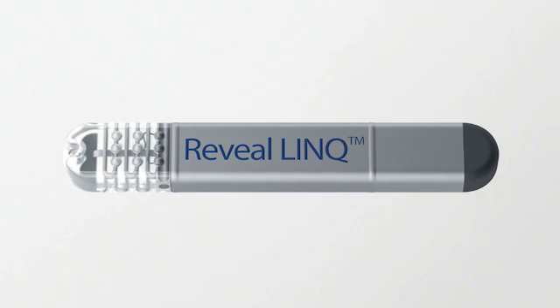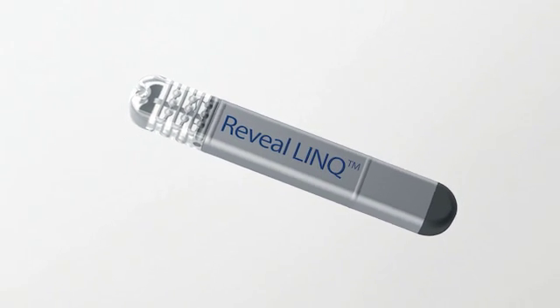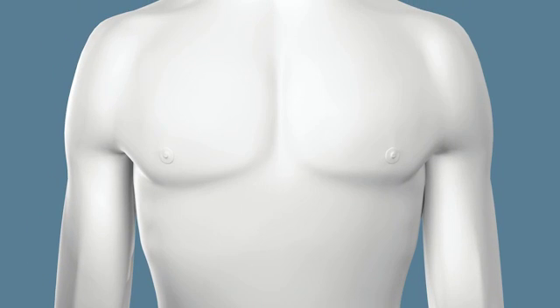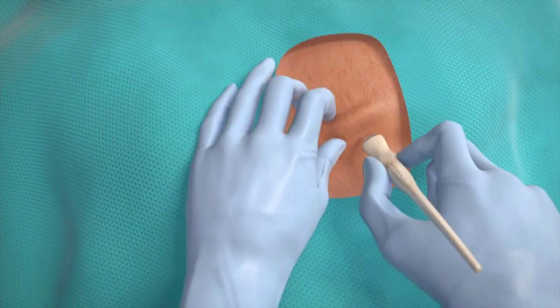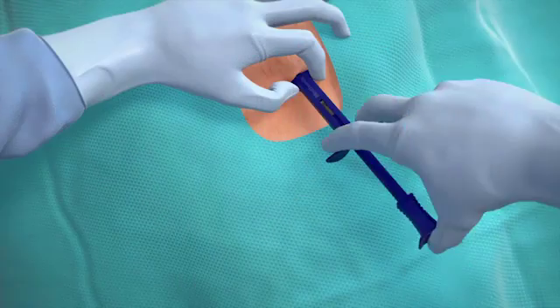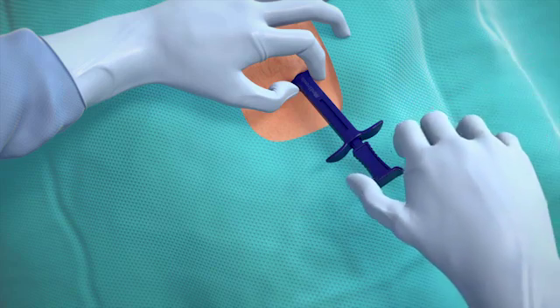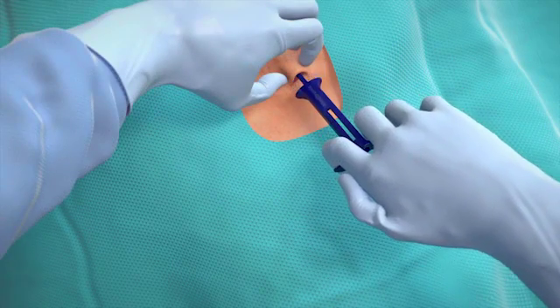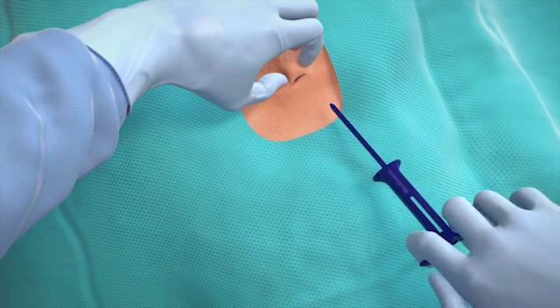The Reveal Link ICM is the smallest of its kind. This tiny device is inserted just under the skin during a short outpatient procedure. Your doctor will pinch the skin and make an incision of less than one centimeter. Then, using a specifically designed tool, the Reveal Link is inserted just under the skin. Once in position, the insertion tool is removed and the incision is closed. As with all surgical procedures, there's a small risk of infection or sensitivity, but such instances are rare.